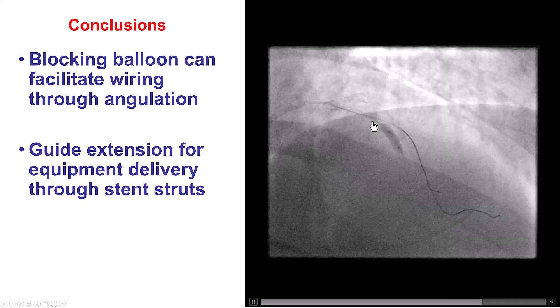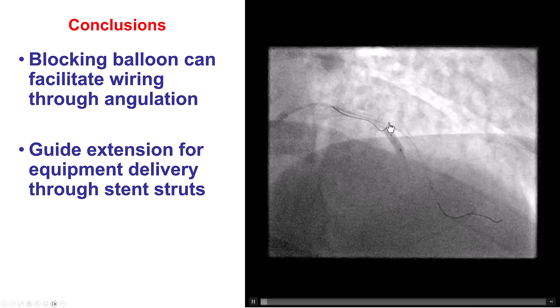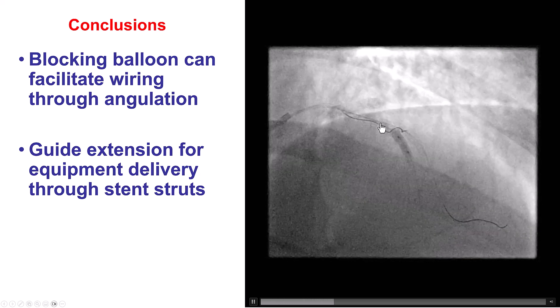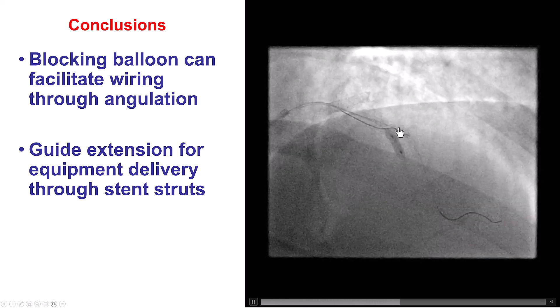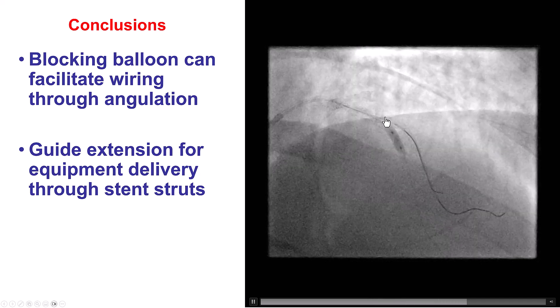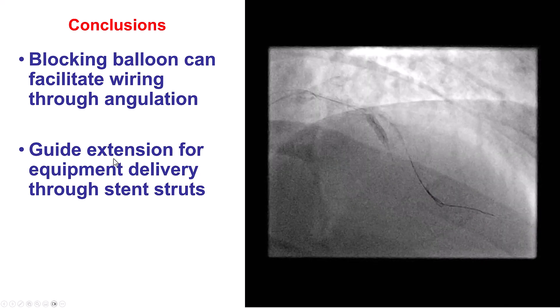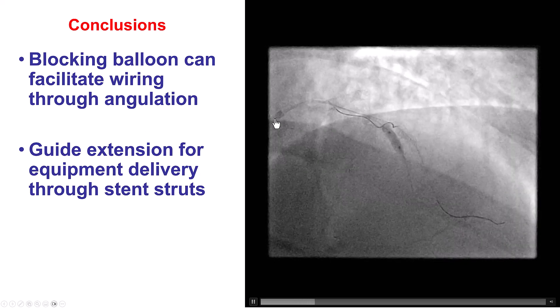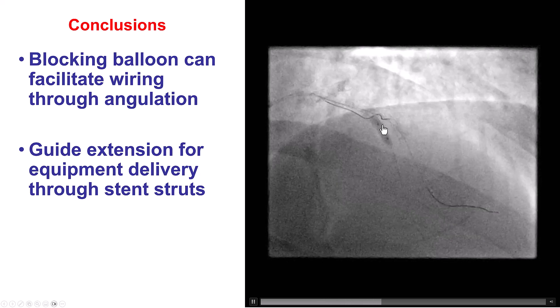In this technique, we inflate a balloon right after the ostium of the side branch, and that balloon blocks the wire from getting into the main vessel and helps direct it into the side branch. We then had difficulty delivering equipment over this guide wire, which was overcome by using a guide extension deeply intubated almost all the way to the origin of the diagonal branch. Thank you.